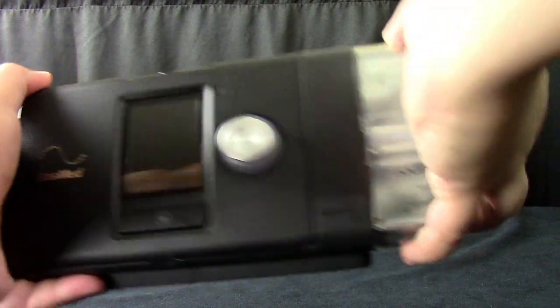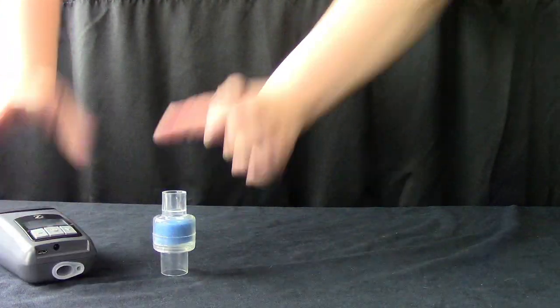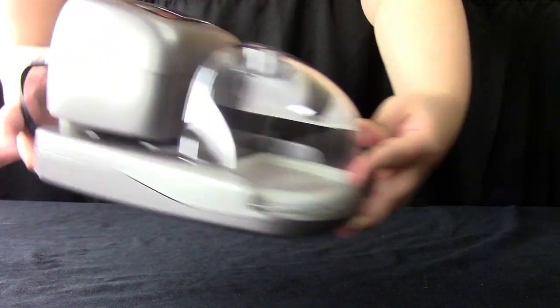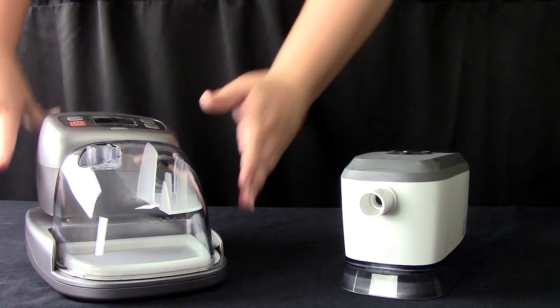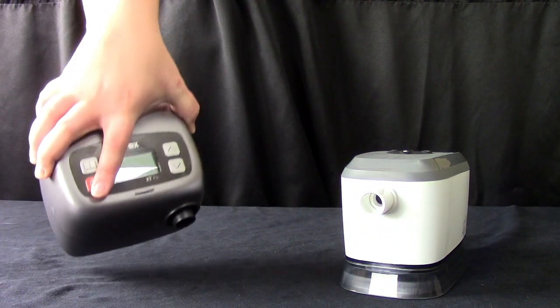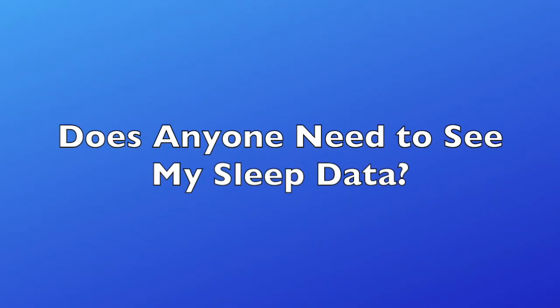Another thing to consider is that your home unit often will have a humidifier, while your travel unit usually will not. Some units, like the Z2 or the Air Mini, use contraptions to lock in moisture. Still, others might have an actual humidifier like the XT Fit or the Transcend 365. Though keep in mind the XT Fit does not automatically come with the humidifier, it's sold separately. Yet you should be aware these units will often add unwanted bulk, sometimes defeating the purpose of having a portable CPAP to begin with.